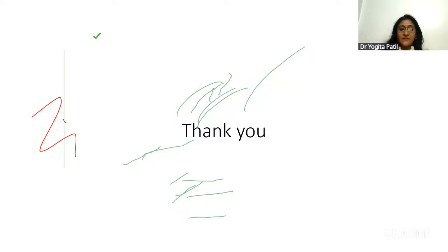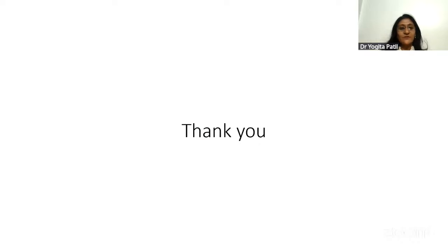I guess a very basic thing is that every day the workstation should be checked before we do a procedure. So what do you think about that, Dr. Harshvardhan? Madam, whatever workstations or anesthesia machines are currently available in the market for sale usually have a pre-use check automated into them. The moment you switch on the master switch, it will tell you to check the ventilator and the breathing circuit. It will do a negative pressure test and a positive pressure test. It will tell you the compliance, and it will tell you the pressures of oxygen, nitrous, and other gases on the machine. Once they are done, you can actually use the machine.